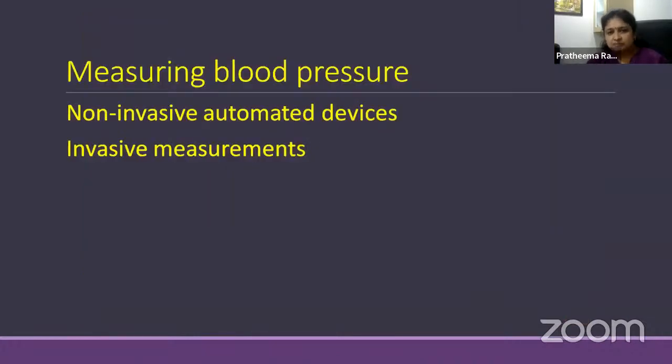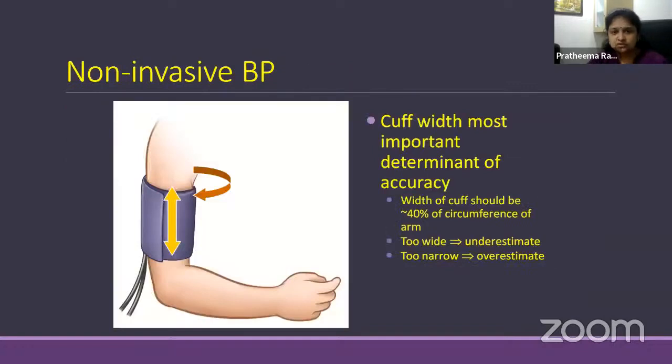So how do we measure the blood pressure? Non-invasive automated devices and invasive measurements. We went through the arterial line in detail. So non-invasive, I just want to touch upon the simple basics, because this is the first thing that we take in our hand before starting the patient on any other monitoring.